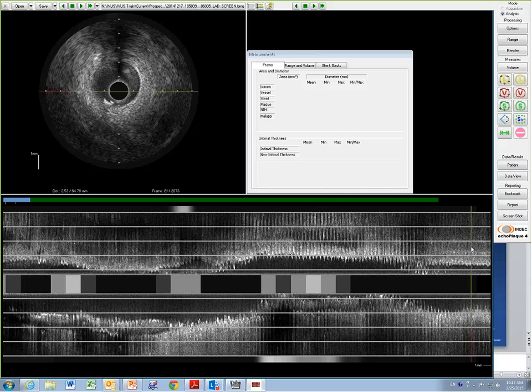I think what I feel is that the resolution of the IVUS picture is already decided, and we cannot change the resolution at all. And usually the picture in the cath lab is zoomed in too much. I can see the picture like this, but when you see the picture in the cath lab, your size is like this, right? So if you expand too much with a not-enough-resolution picture, sometimes the picture even looks worse. But I think those things you understand.